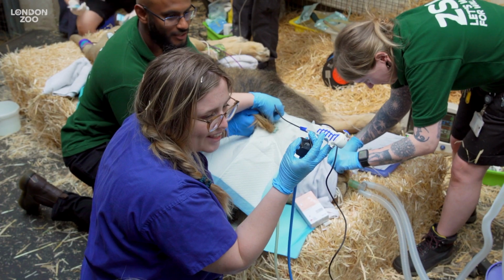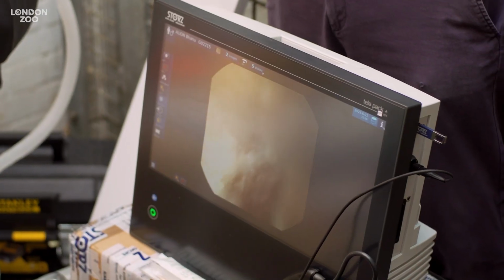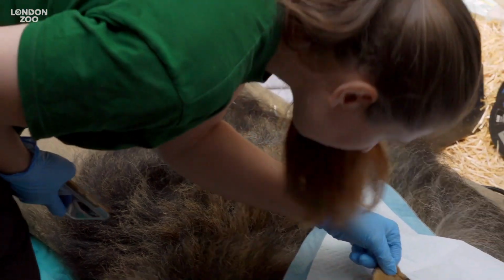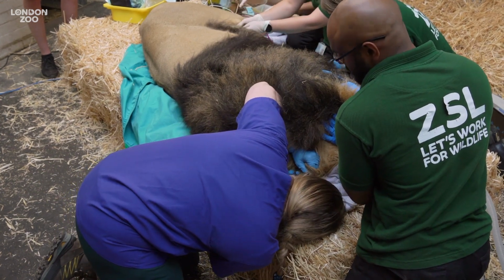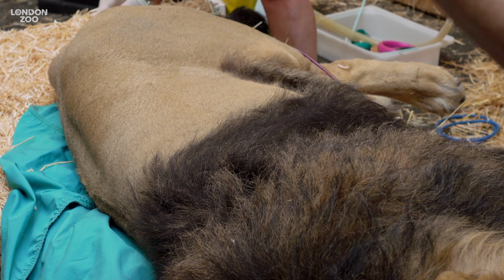We found that it was still a little bit closed up, but not as much as it was previously. There was a fair amount of wax in the ear, if you will. We had to flush out and clean out that ear to make sure it's as comfortable as we can get it for him, and he's well on his way to recovery. So while we had him under anesthesia, after we'd given his ear a really good clean out and had a really good assessment of that ear, we put in some long-acting ear drops that contain some pain relief and some anti-inflammatory, as well as some antimicrobial ingredients to help combat what is going on right in that ear.